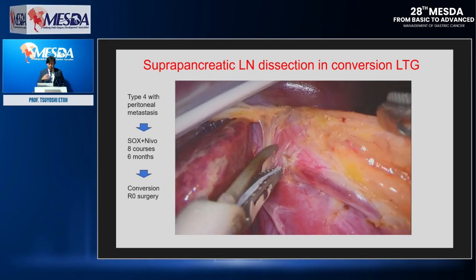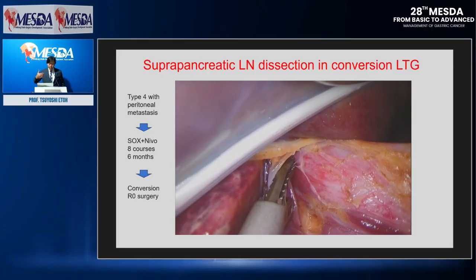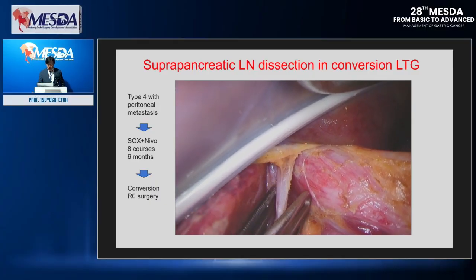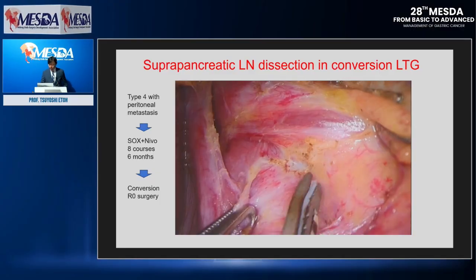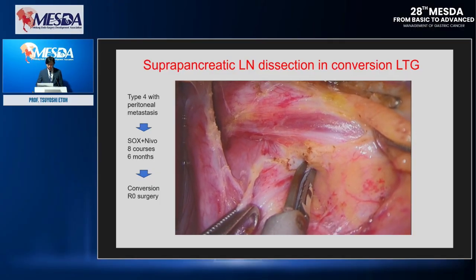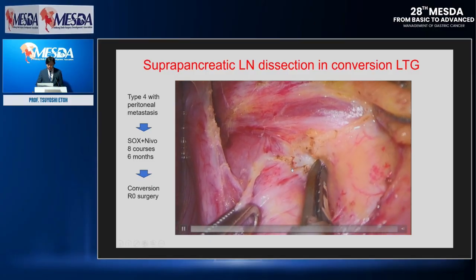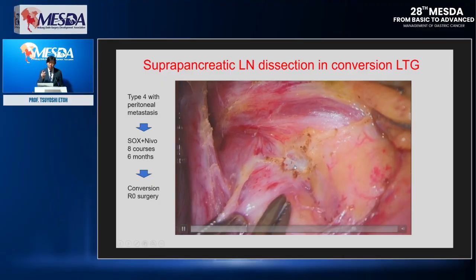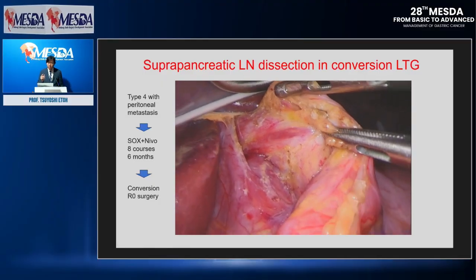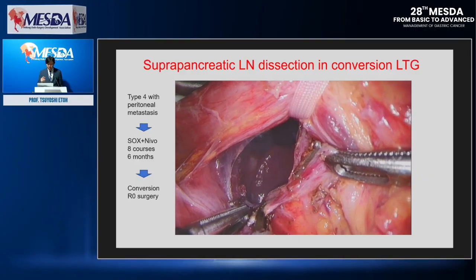First, we dissect around the esophagus and the upper side of the stomach. Everywhere, hard deposits were there after the chemotherapy.